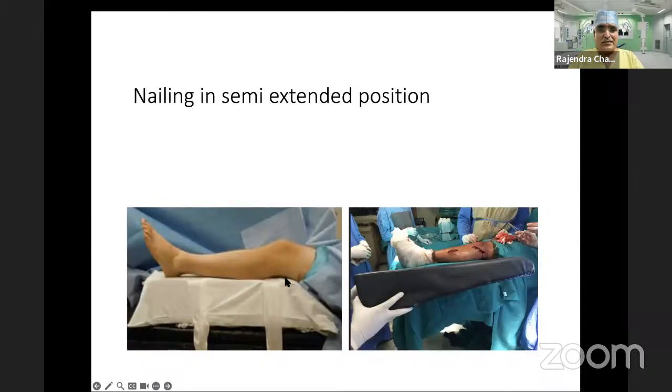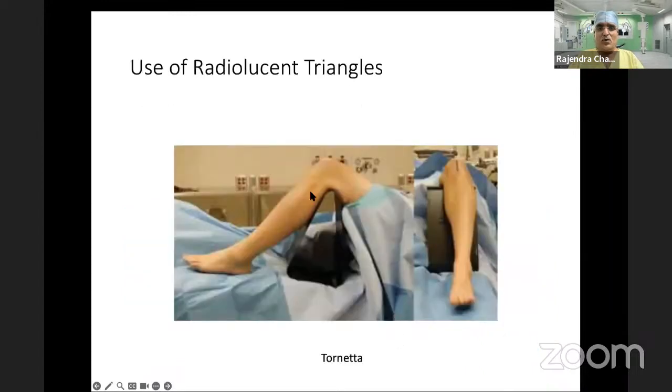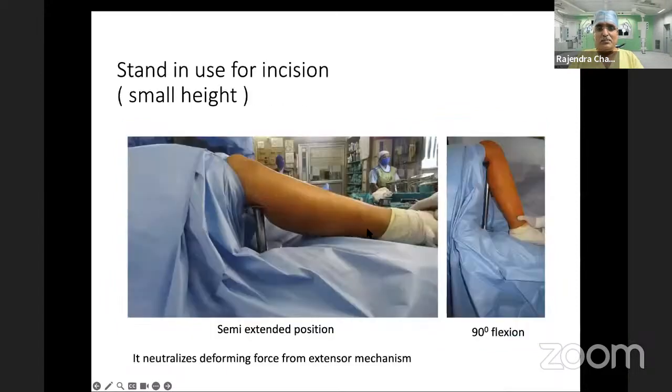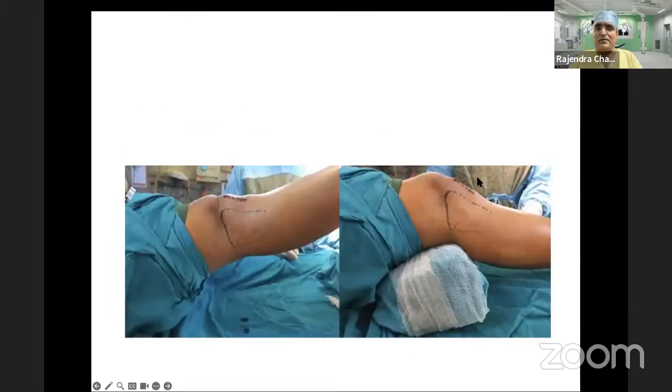And this is what is recommended for nailing in extension: pillows or soft cushions or triangles. This is Tornetta's diagram. Or I like to use a modular stand, which you can make of different sizes and different shapes. So I use a stand. The advantage is somebody can give traction on that stand, either in 90-90 or semi-extended. And that serves very well.